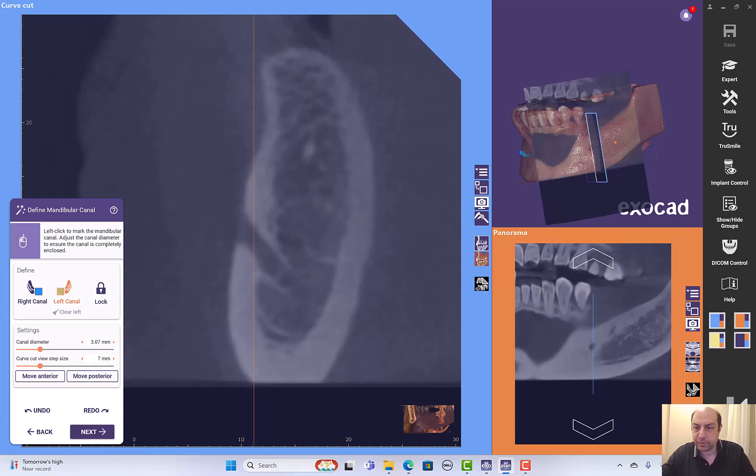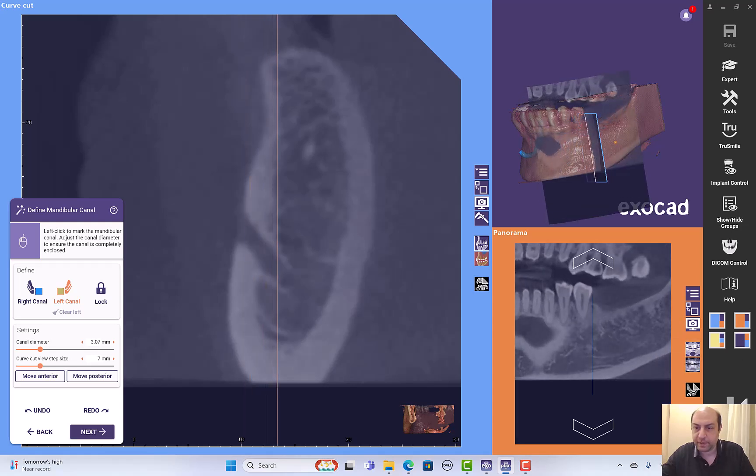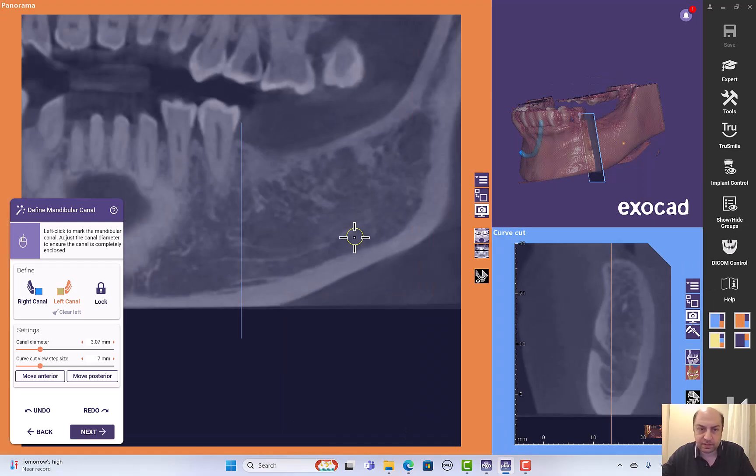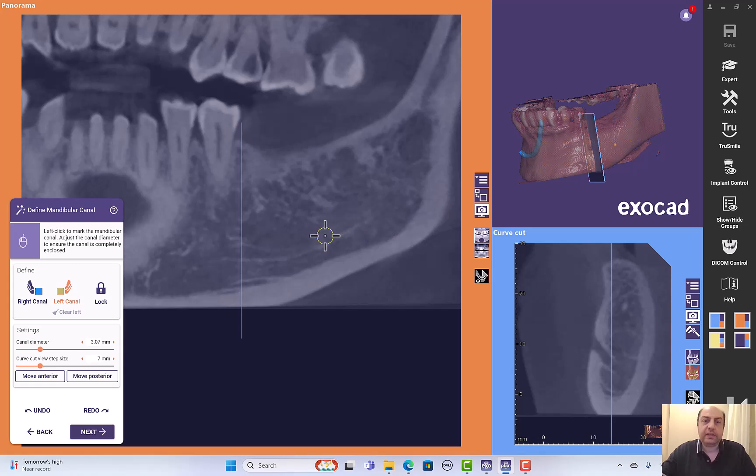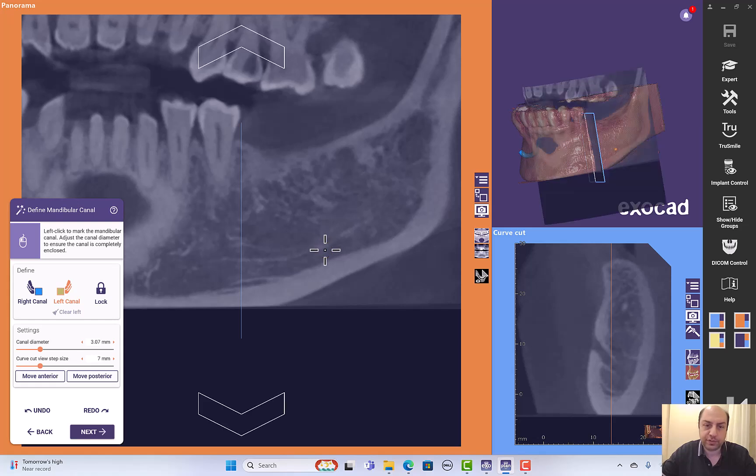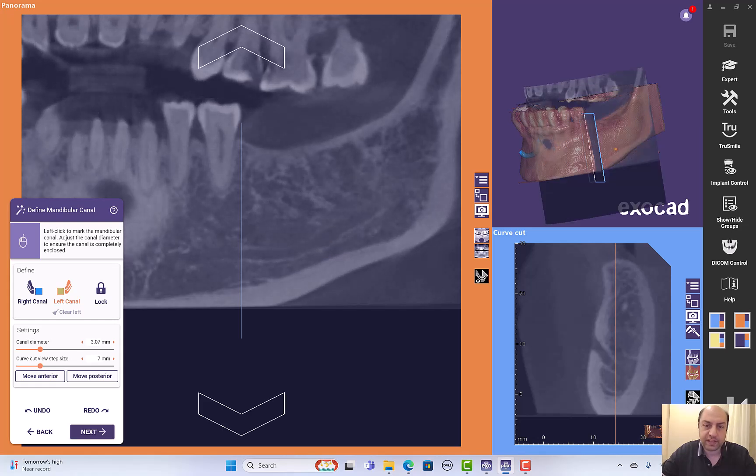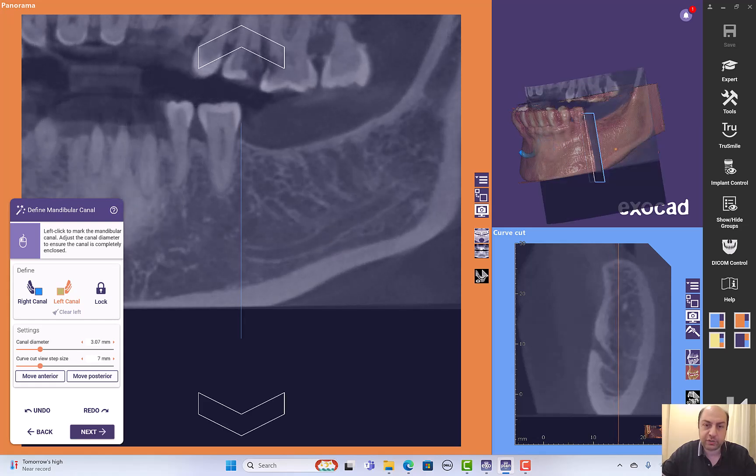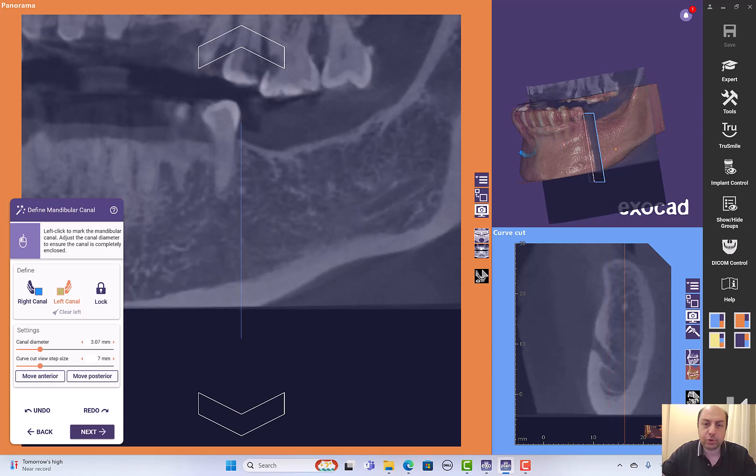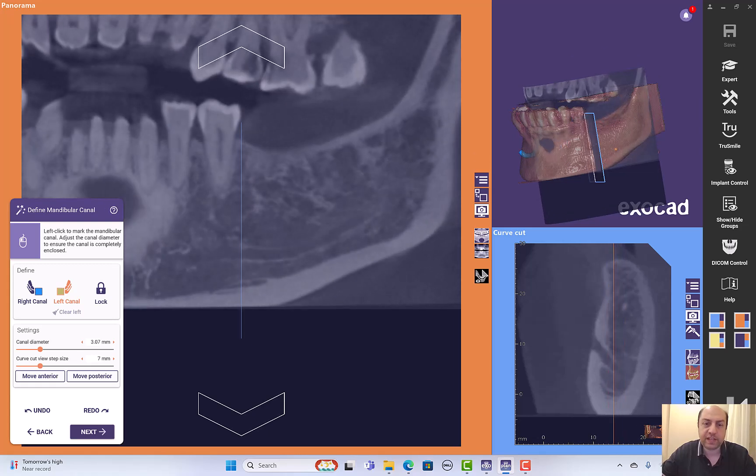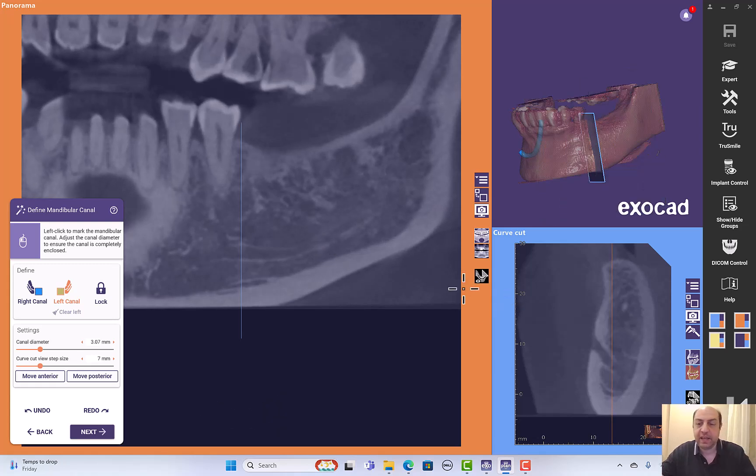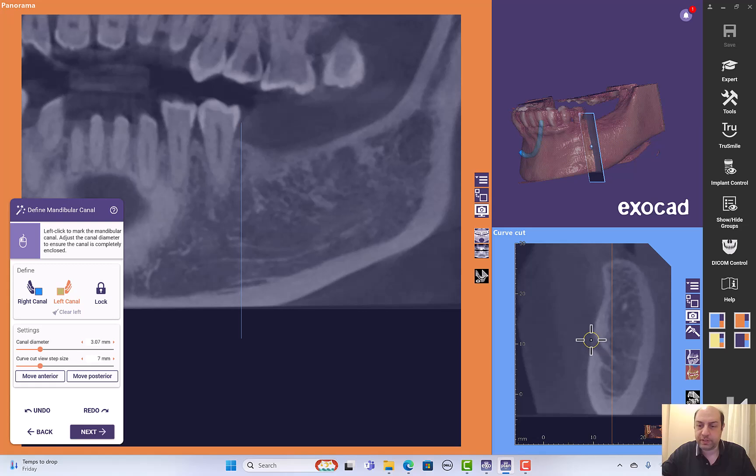Drawing the nerve in the panorama may be tricky. You have to get the best cut where you can see the nerve or the canal. As you can see, like this cut going back and forward, you may lose the canal, so you have to place it in the right area. But I prefer always to start with the mental and start from the cross section.